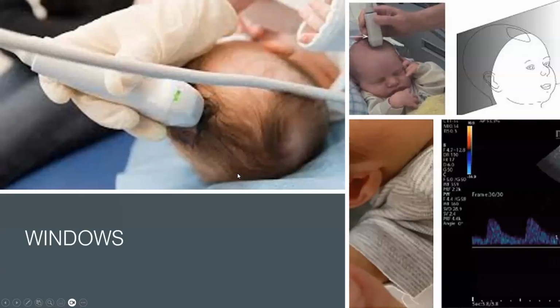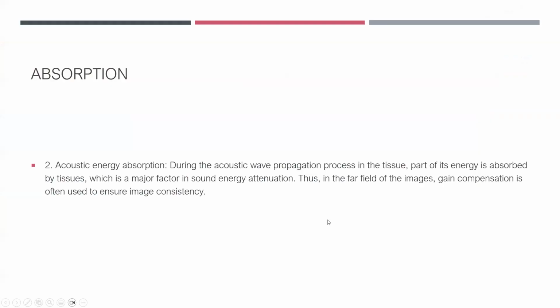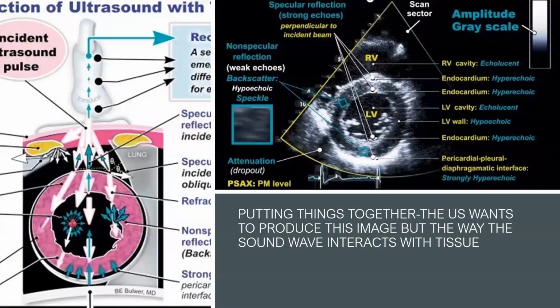If you do not keep your probe in the right place, you are not going to get good quality images. But more importantly, your angle of inclination will suffer, and you will get a wrong velocity. You will calculate your RIs incorrectly. This can be quite significant if you want to do prognostic evaluation of a baby with HIE.